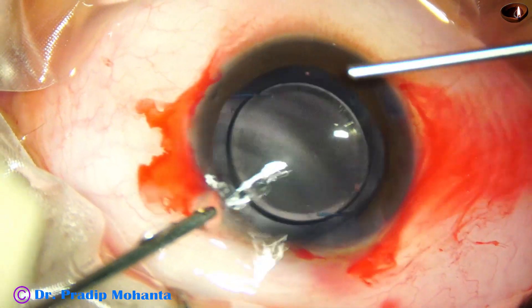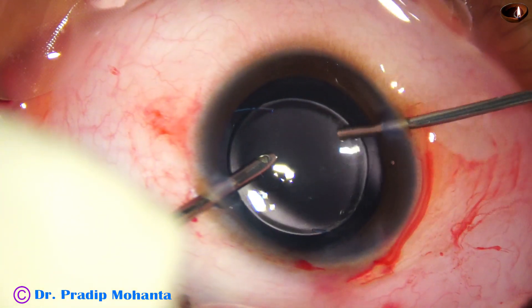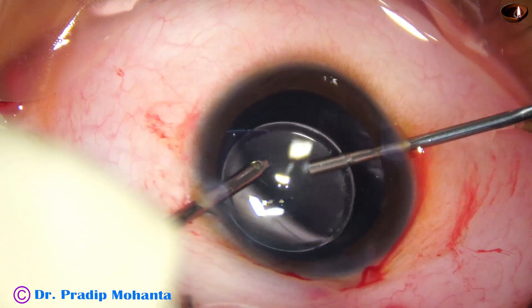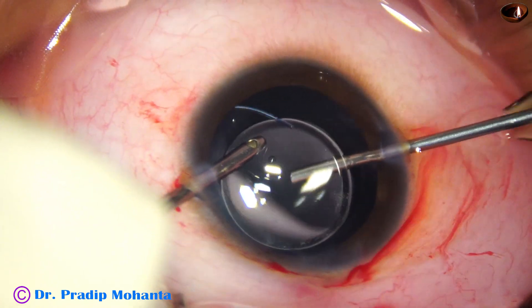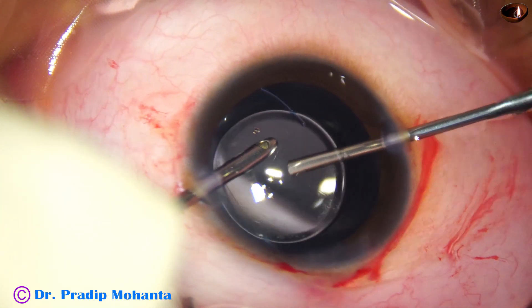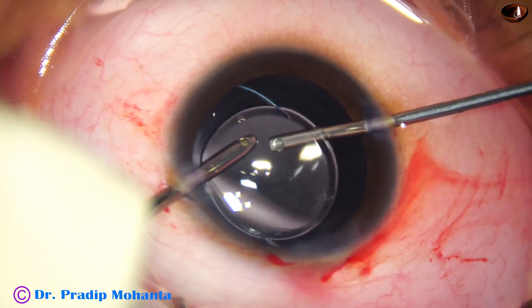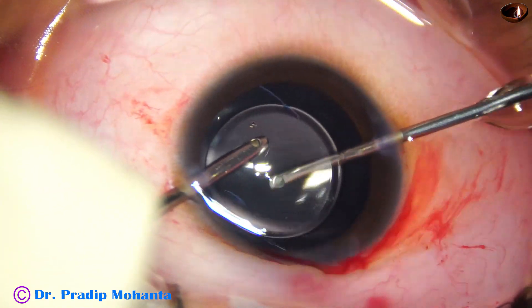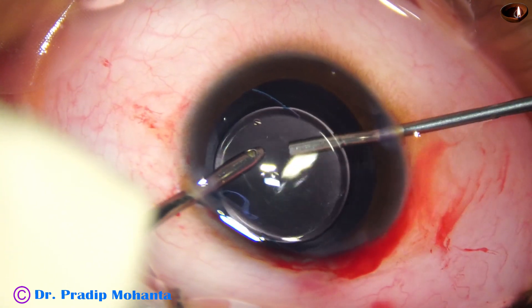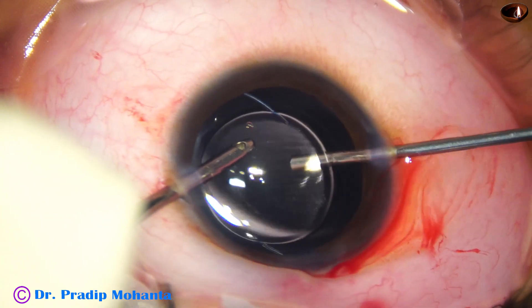Now I take the vitrectomy cutter, 23G. Irrigation from the right side goes above the lens, and the cutting goes below the lens, down at the center, directed towards the vitreous cavity. In this case the machine was set to 3000 cuts per minute with a vacuum of 200 mmHg. A very nice opening is made.